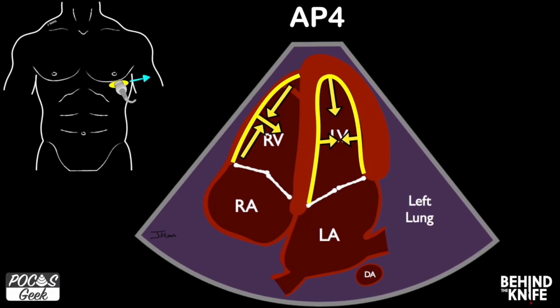In the apical view, we're going to look at the left ventricle shorten, and that can be the base coming towards the apex or the apex coming in, and then these walls closing into each other. On the right ventricle, most of our contraction or ejection fraction is going to happen along the longitudinal plane. It's about 70% or two-thirds, somewhere in there. And then we get some of the movement into the free wall and towards the septum.